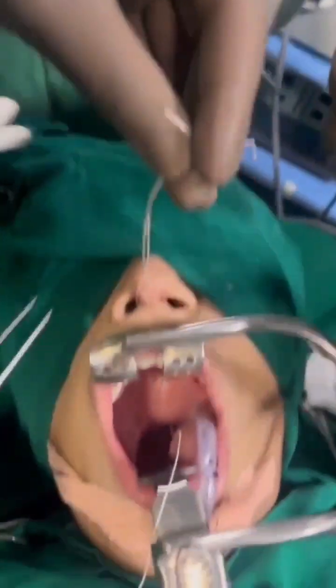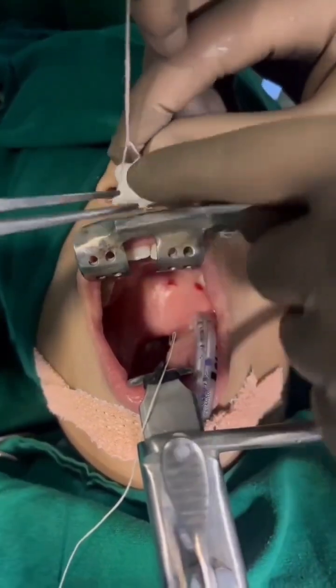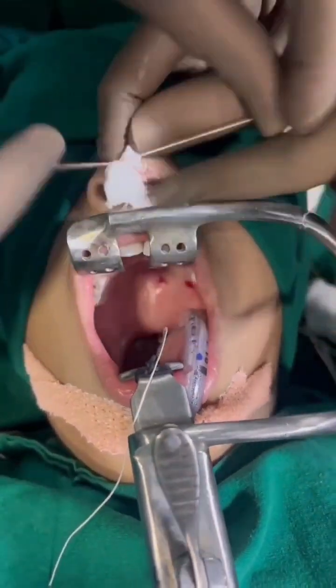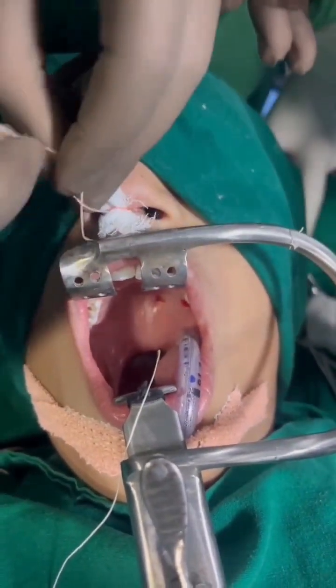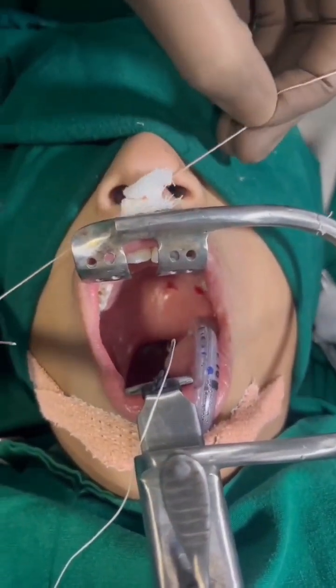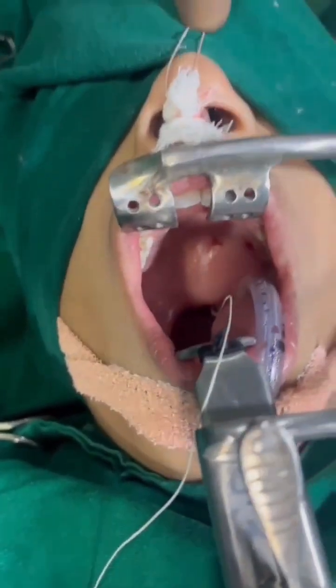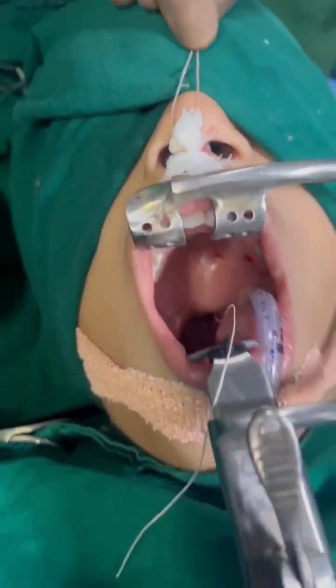A very small piece of gauze is required. We tighten this knot — one more knot. This pack is kept for 48 hours. The patient can be kept intubated or can be extubated. While removing this throat pack, we just cut this thread and pull out from the oropharynx.